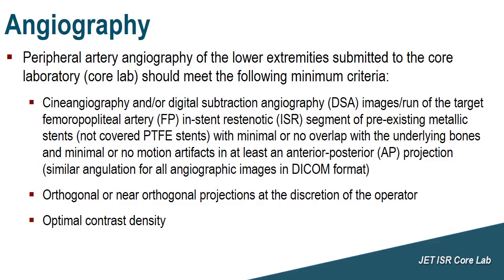Orthogonal or near orthogonal projections are at the discretion of the operator. As you can understand, if you are looking at stent fractures, orthogonal projections might be important. However, it might be difficult and not routine. So whatever you do at the beginning of the procedure needs to be repeated at the end of the case.